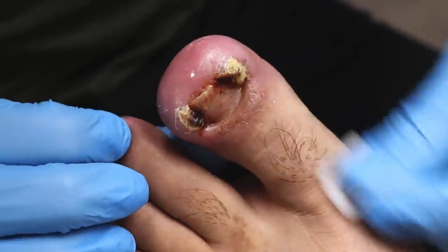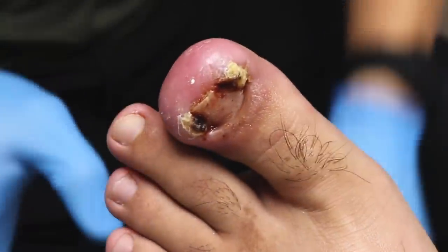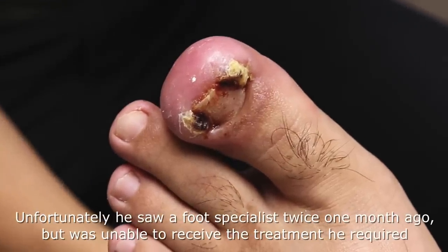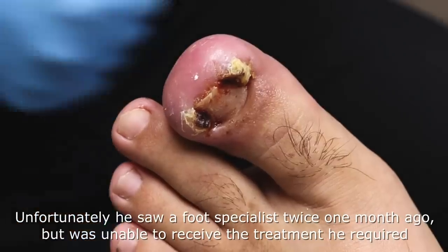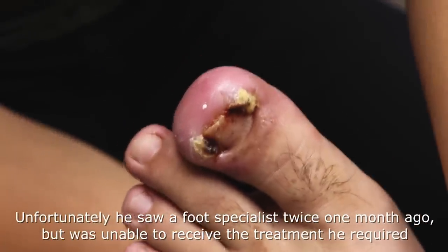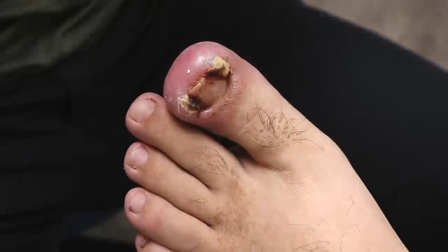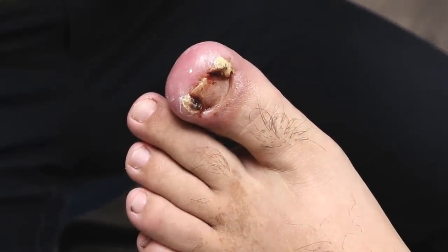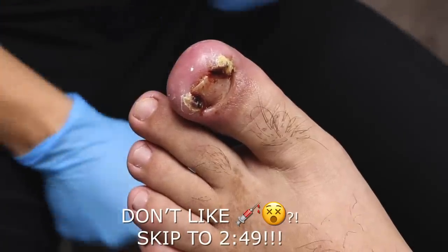I'm just gonna wipe down the toe. Let me tilt your back a little bit more. So this is how we make it as easy as possible. When you feel the pinch, don't move your foot. What you're gonna do is just push your foot down just like that if it really hurts. But it's a very small pinch, a little bit of sting, and it goes very fast. Best thing you just do — breathe, push your foot down if it hurts, and that's it.